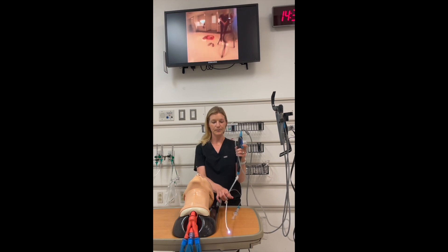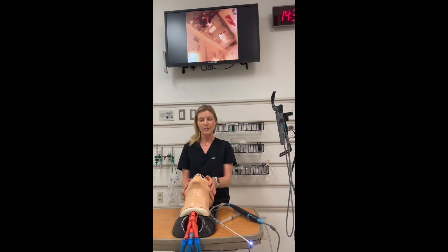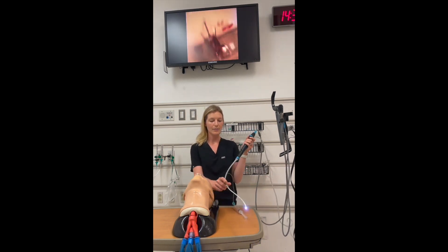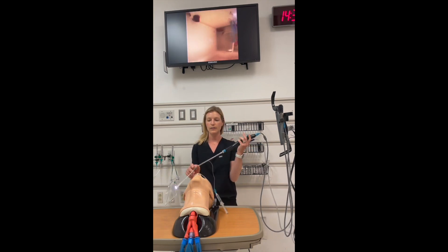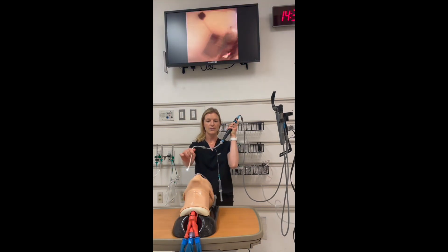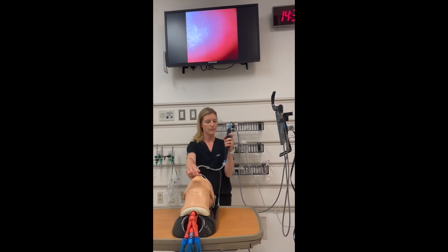Now let's perform the procedure. To begin, maximize your patient's position. The patient will either be in the sitting position for an awake intubation, or in the supine position — but in the sniffing position as shown here. You really want to maximize your visibility as much as the scenario allows. With my tube preloaded on the scope, I'm going to place the tip of the scope in the patient's mouth, keeping the scope as taut as possible to maximize control.